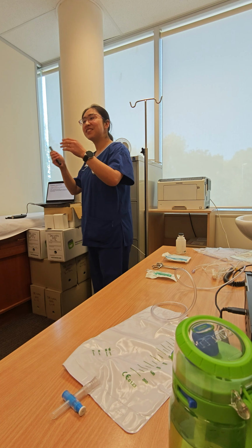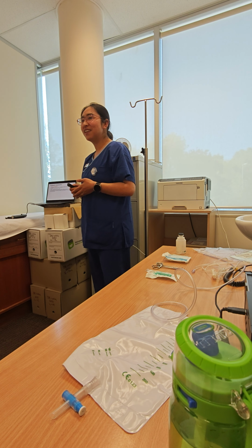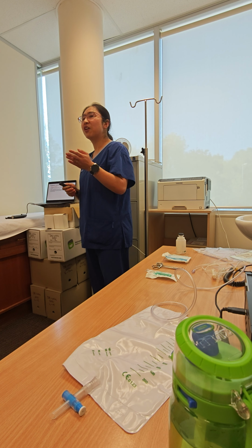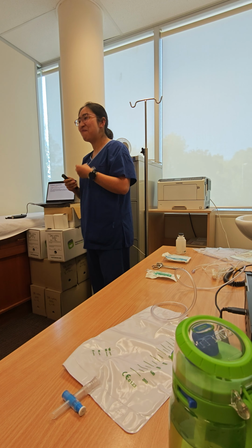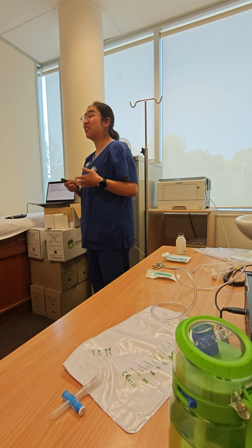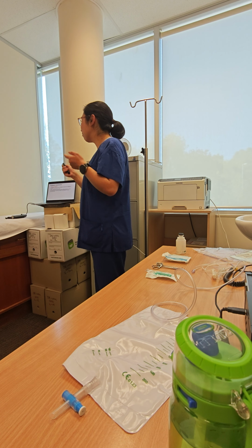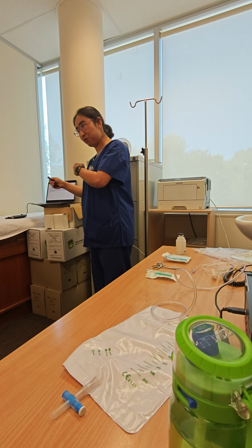All right, what is a cystogram? Cysto means bladder. A gram is a medical suffix. It's a Greek word meaning a record or pictures. So cystogram means we're going to take pictures of a bladder, but how? We're going to use X-rays. To be specific, it's fluoroscopy, a kind of dynamic real-time X-ray.